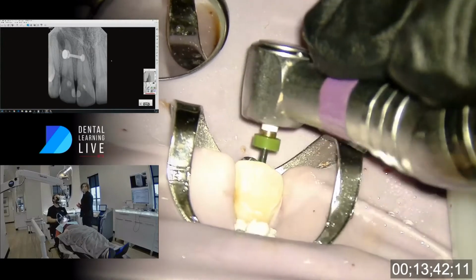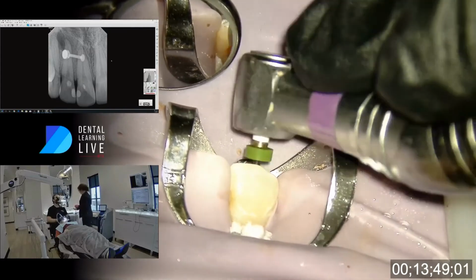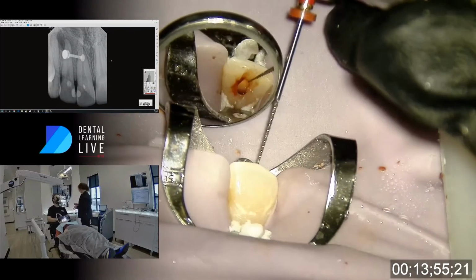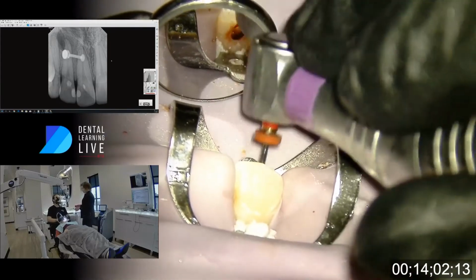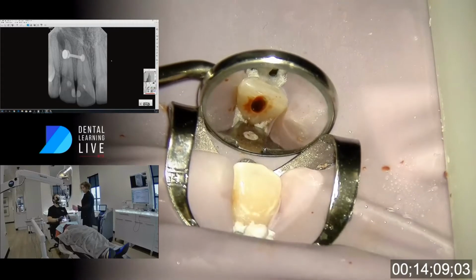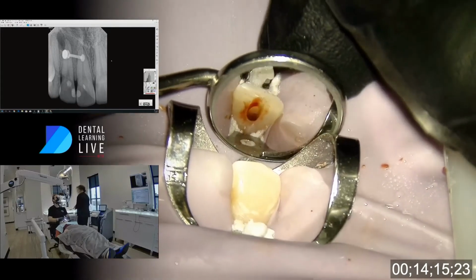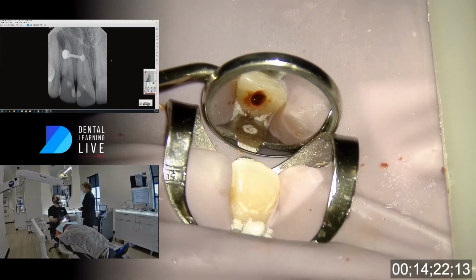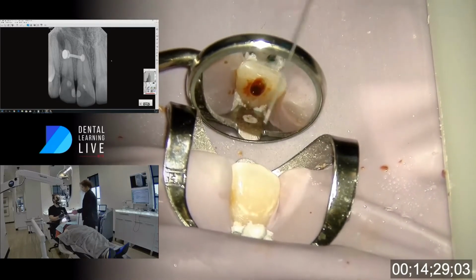All right. What do you want next? Let's go up to 25. Okay. 25. Yeah, you know what? A lot of what we're doing now is thinking about the GentleWave in mind. And one of the things that I've done is becoming more kind of directly parallel, so higher to the incisal edge. Candidly, because it just creates a better seal for the GentleWave. When I get a lot of drainage, I want to make sure I'm actually generating the mechanism of action and enough force to sort of drain what's going on in here.